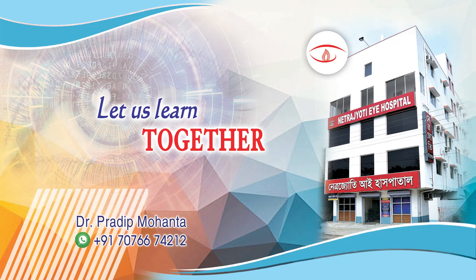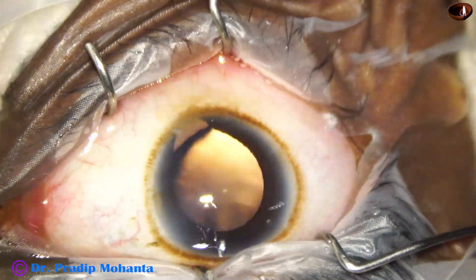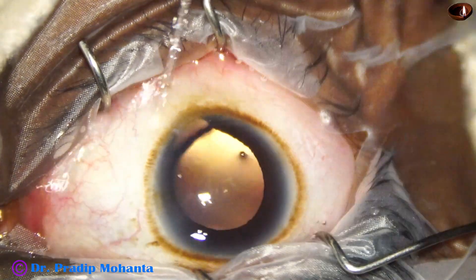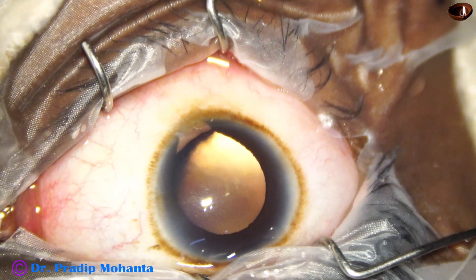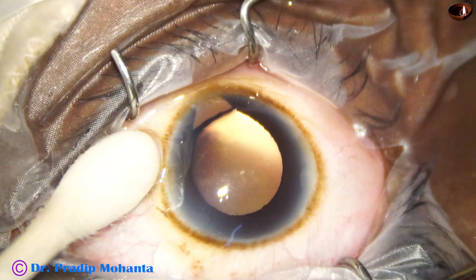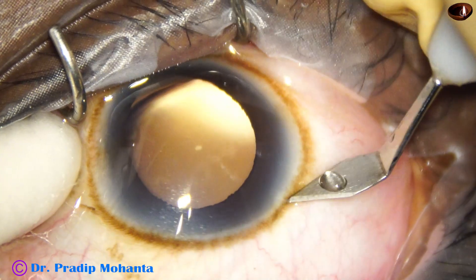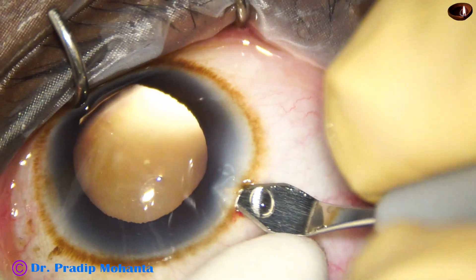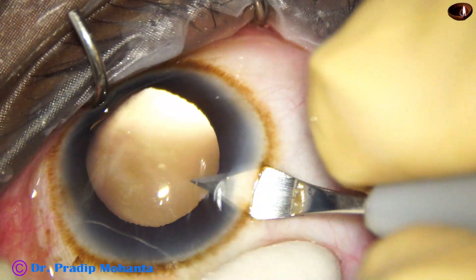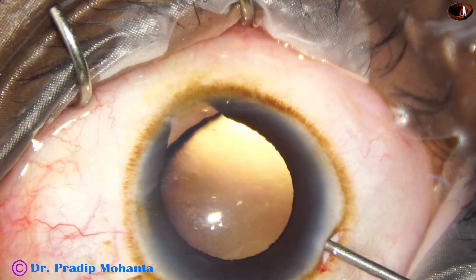Friends, welcome to my workplace at Ranagh Heart, West Bengal, India. This is a myopic eye with coloboma iris and coloboma choroid. Preoperative refractive error is minus 22 diopter of spherical error and minus 6 diopter of cylindrical error. But the difference between K-readings is only 1.5 diopter, so it was lenticular astigmatism. There is very mild cataract — almost a clear lens.